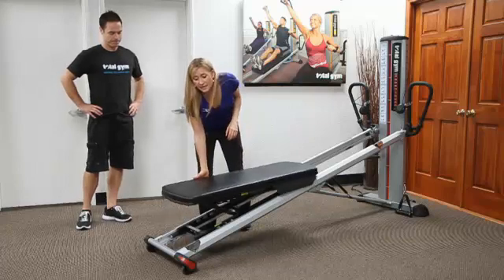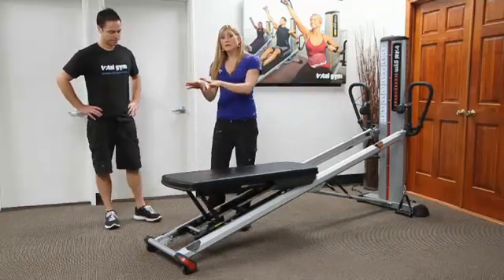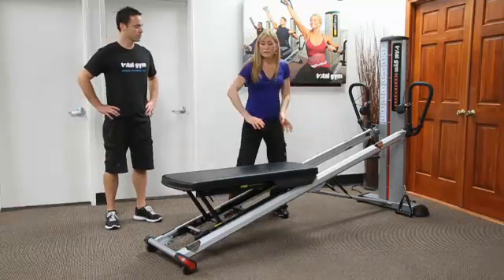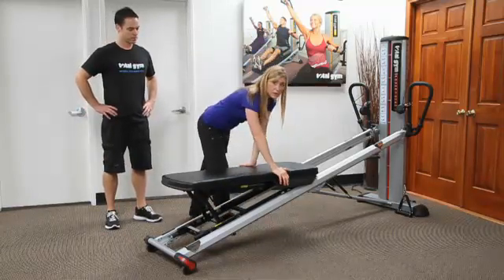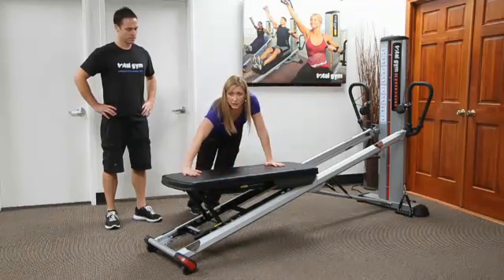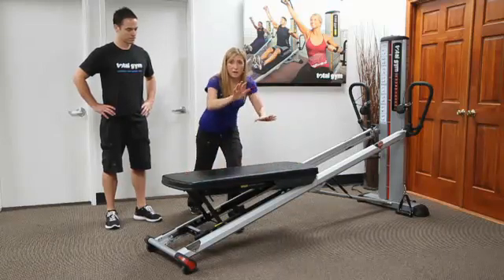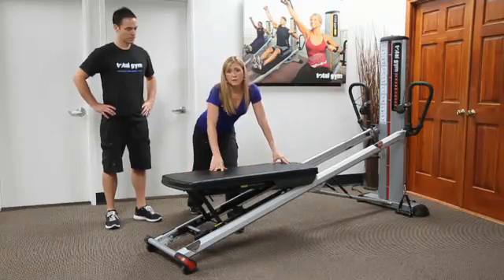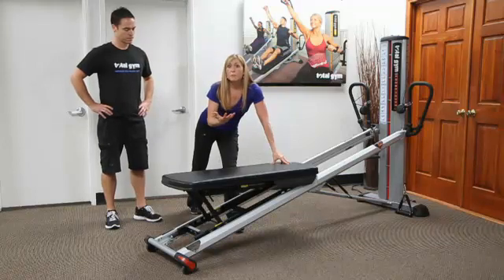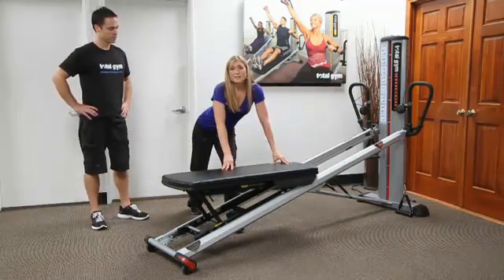But what's nice is that I can bend this all the way up, and this will help segment our way into when we discuss the tower and the incline. But the fact that if this is too narrow of a base of support when doing your planks, you can now move to this position, and now they have a nice array and a nice space where they can move, and they can do staggered position, and they can then accommodate for any restrictions in the shoulders or any mobility or strength requirement or strength limitations. So that's the glide board.